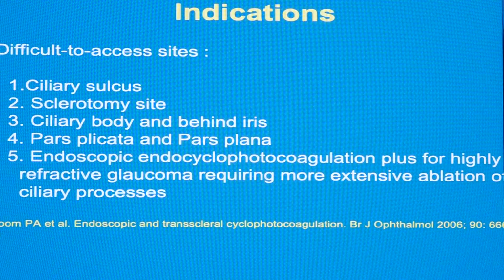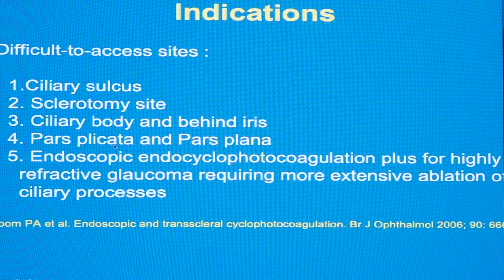So like I said, what are the indications? Difficult to access sites like ciliary sulcus, sclerotomy sites, ciliary body, and the area behind the iris, and that is where its importance lies in the practice of uveitis.